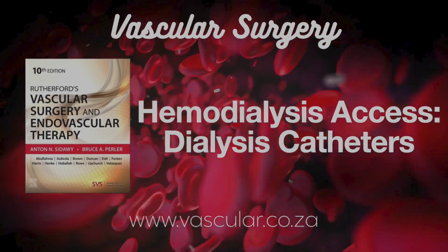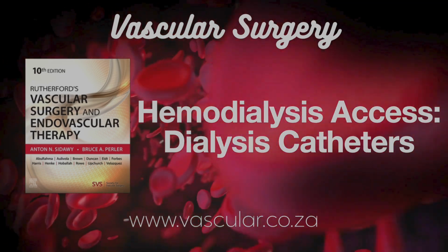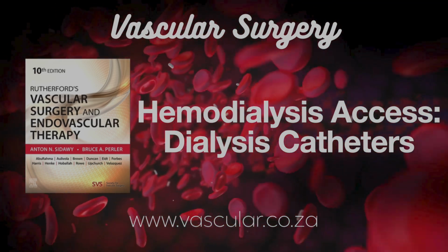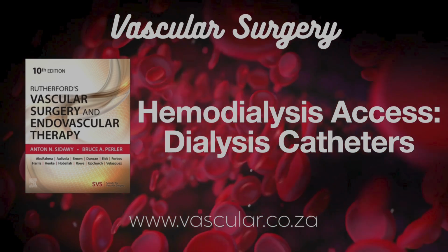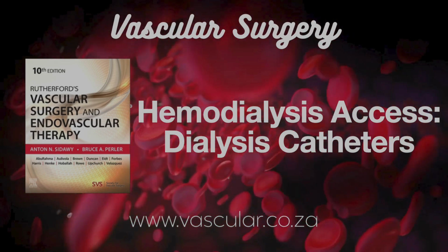And if it accidentally goes into an artery, carotid or subclavian? More likely if the patient's blood pressure is very low, so you don't get that bright red pulsing blood back. Rare with elective placements. If suspected, check pressure or blood gas. If caught immediately, maybe just pressure after removal, but often needs surgical repair because the sheath makes a big hole. If found later, definitely needs surgery.